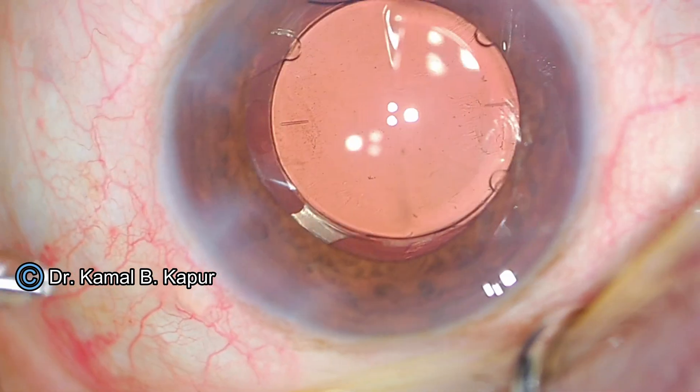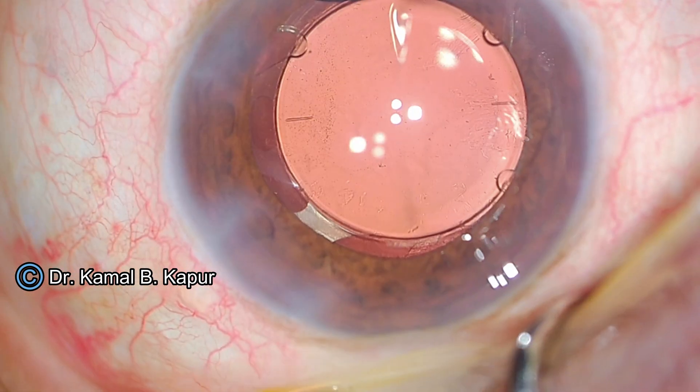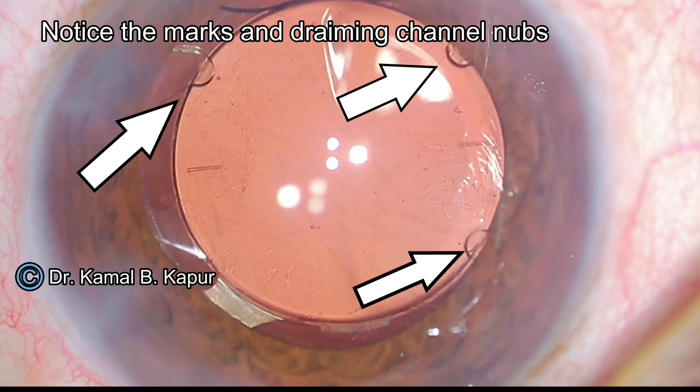Sometimes you may have some residual viscoelastic behind these IOLs. But there are draining channels which you can see on the sides of the lens, from which the viscoelastic will eventually drain out. These are the draining channels which were just demonstrated. Thank you.